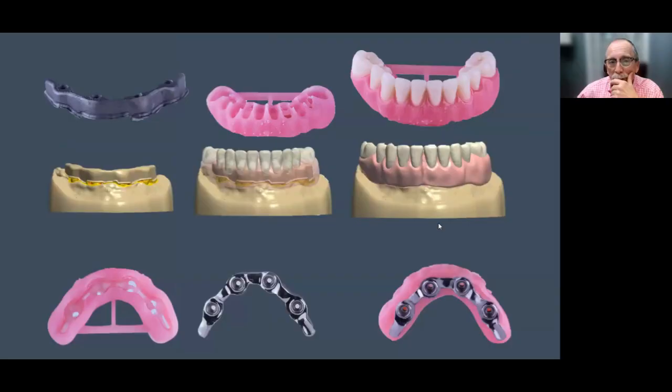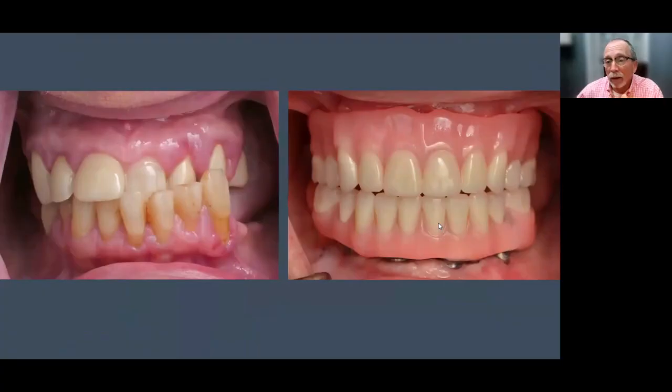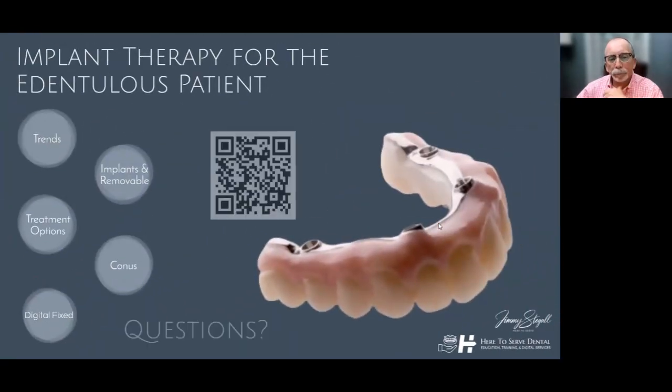They go straight to the zirconia. But it could be a zirconia overlay. It could be a printed denture overlay. It could be a milled PMMA overlay. We have all the options, and to pick what and where. Dr. Ludlow, for this case, picked a printed denture overlay over the bridge base bar, because the denture he was opposing was a printed denture. That was the reason he picked that.